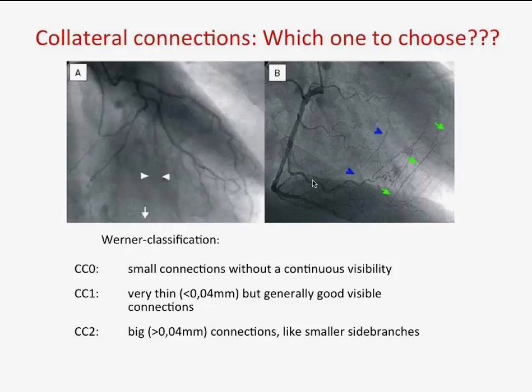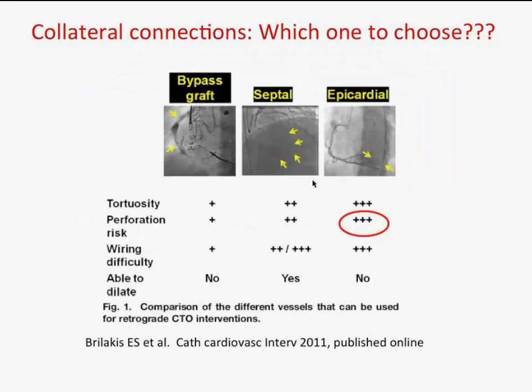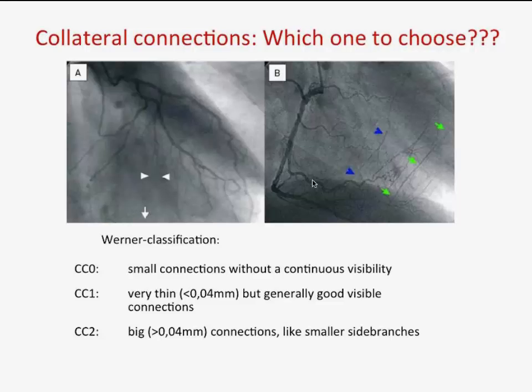When you destroy them, they make a big hematoma. So the best thing is probably to go for septal surfing. That's my personal point. And after this, if this fails, I'll do a super selective injection regarding CC1 and try to pass them. Perfect. And how long do you typically try the surfing, 5-10 minutes or?